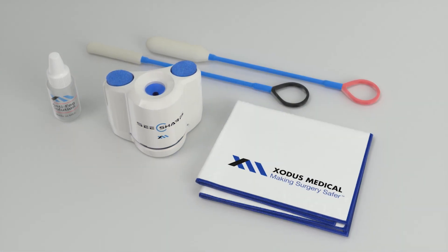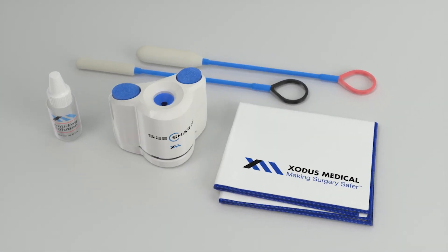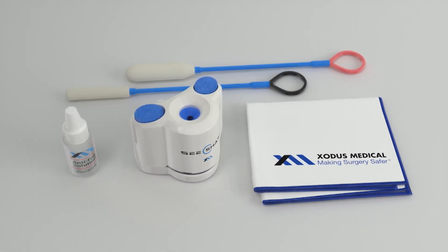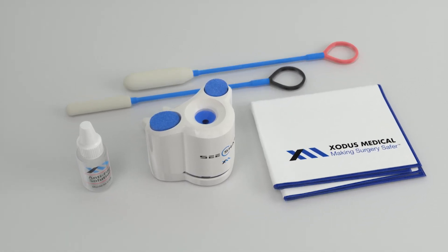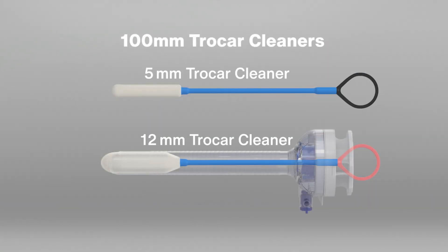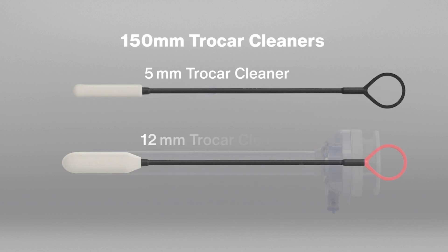Each See Sharp kit includes one See Sharp unit, a white balancing microfiber cloth, one 5mm trocar cleaner, one 12mm trocar cleaner, and one bottle of anti-fog solution. Kits are available with cleaners for both 100 and 150mm trocars.